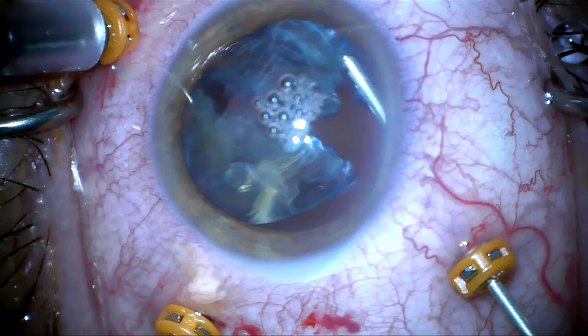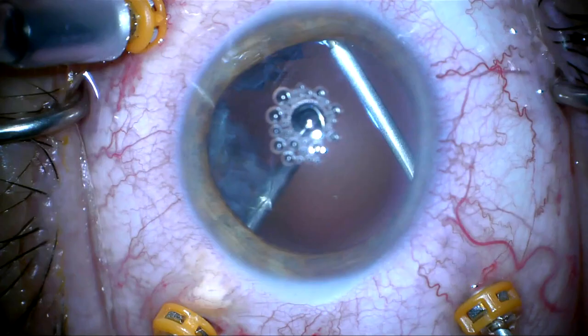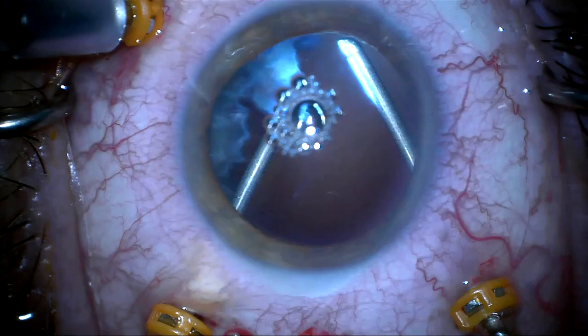I've sped this up to give you a better idea of what this really looks like — a more global view of how this lens is handled. I'm trying to keep the capsular bag surrounding the nuclear material intact as I vitrectomize this, so pieces don't fall back.